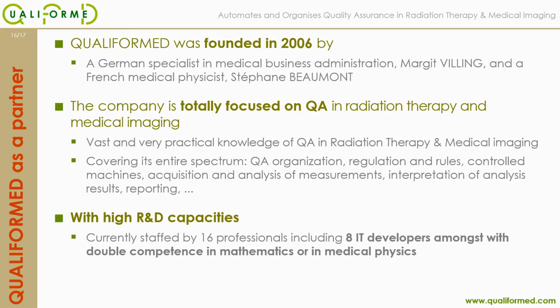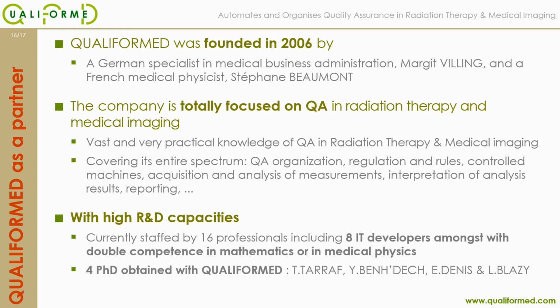4 postgraduate degrees were carried out with or at QualiFormed. Taraf Torfe, Yassine Bendesh, Eloise Denis and Leon Blasi, which I cite to demonstrate that QualiFormed has the capability to continue our R&D program on CYBERKNIFE installations to automate the AQA test and make our system a pre-treatment quality control system.